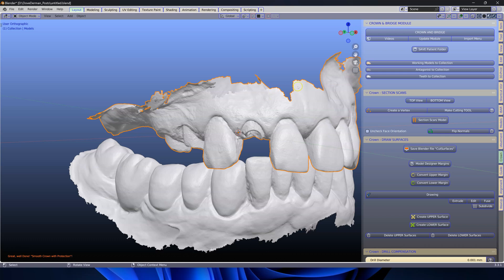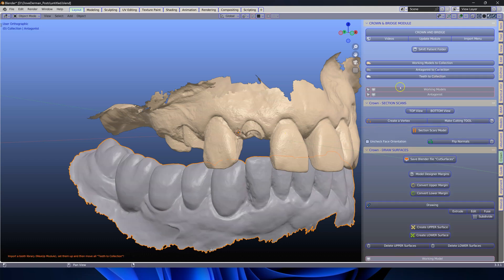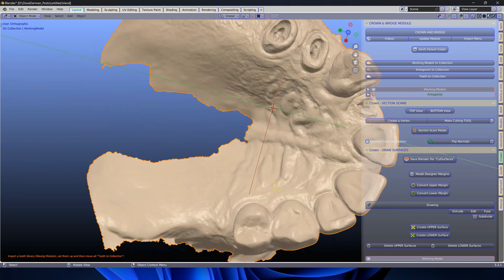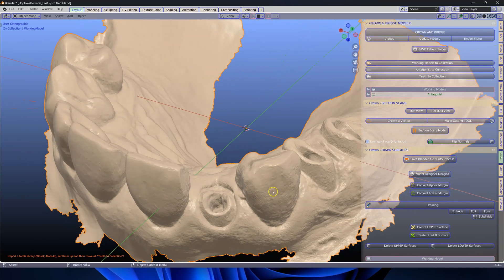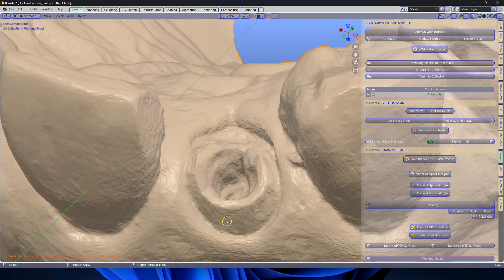The first thing we're going to do is we're going to sort through the model. This is my working model and this is my antagonist. I'm going to hide the antagonist over here. I'll flip this over. I'm using a space mouse which makes it really easy to manipulate.